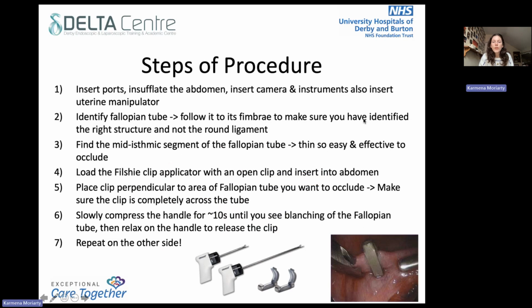So steps of the procedure, I'm just going to talk through laparoscopic sterilisation using Filshie clips.